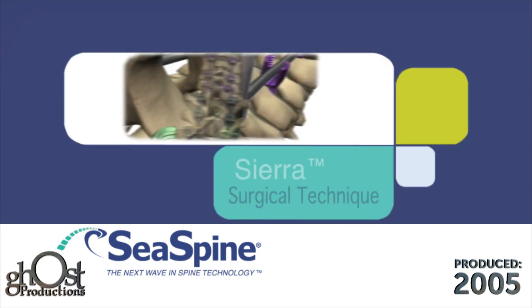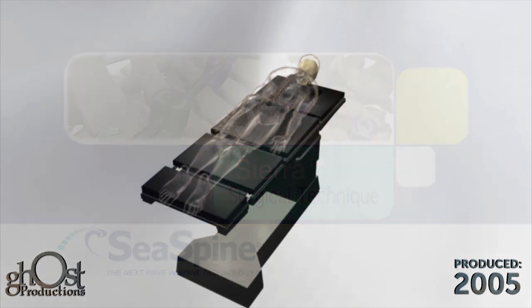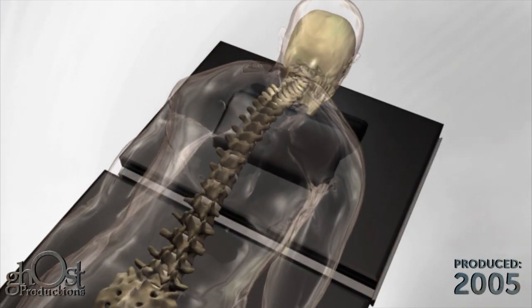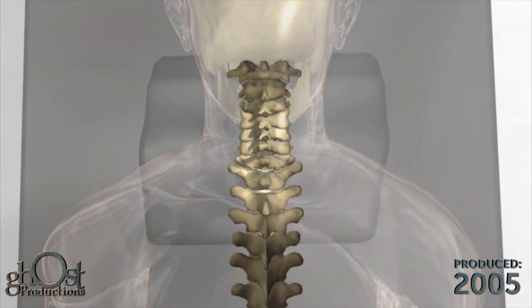The Sierra Occipito-Cervico-Thoracic System is designed to facilitate reconstruction of the posterior cervical and upper thoracic spine. The patient should be placed in the prone position. A midline incision is made and dissection is completed down to the appropriate vertebrae.